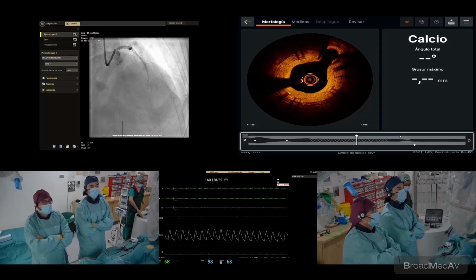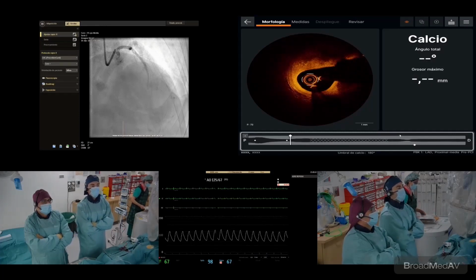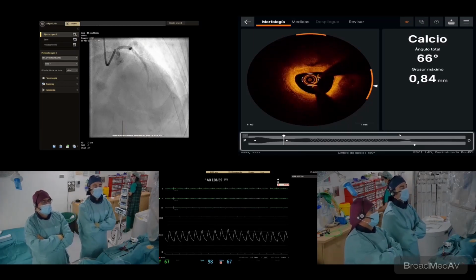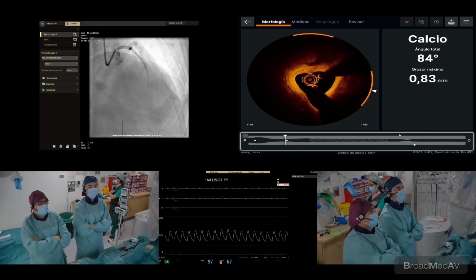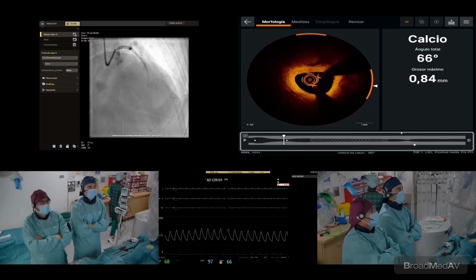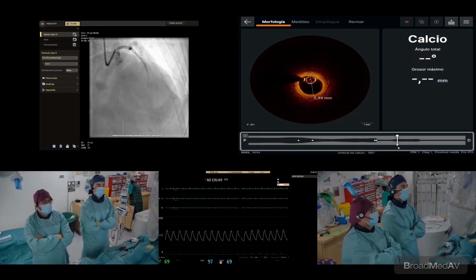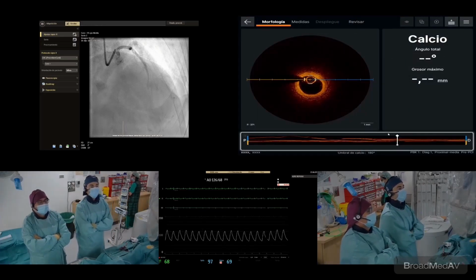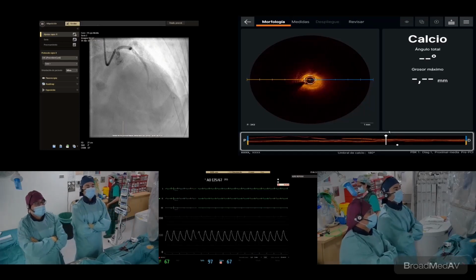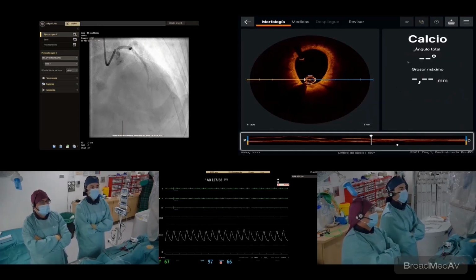And the problems come again at the proximal LAD. This is the stent, the other wire in the diagonal, and this is the proximal plaque that in the angiography was moderate to severe, but here in the OCT, it's a lipidic plaque with a luminal area under 3 or near 3. So here we have been discussing and probably we need to treat it. And we can show the OCT from the diagonal, 2.4, 2 point something, 2.5. And then you are going to see the severe lesion here. It's occlusive. And when we come back to the LAD, this is just in the ostium.